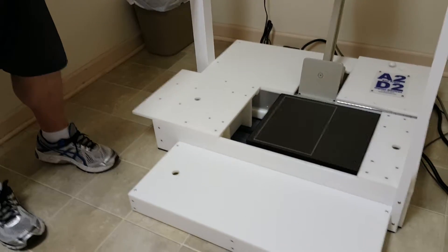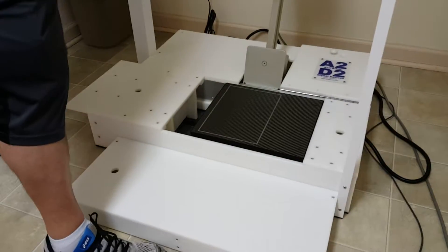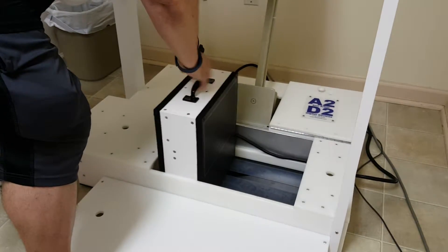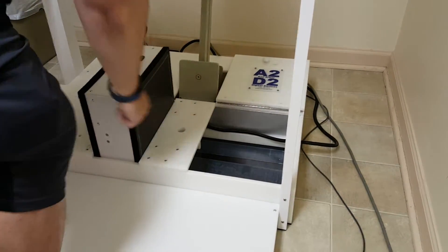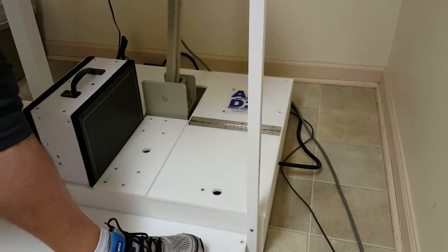Step number two: I do this with my pinky for effect, because you want to know how heavy it is — it weighs about 18 pounds. But I never lift it; I simply slide it into place. Step number two. Step number three: I've got a hole for my finger. Step number four: the door closes. Step number five: now you can do the lateral.